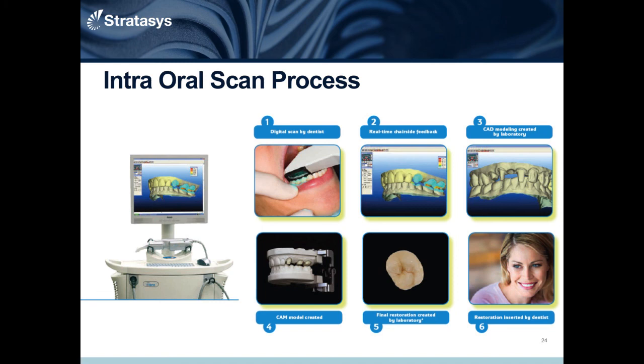This decreases your turnaround time, which adds more value to the services and products that you provide. Your doctor gets a better experience, the laboratory has a better experience, and most importantly, the patient has a much better experience. So this whole idea of intraoral scanning, if I talk to most laboratories today, well, I get one, I get two, I have a couple doctors, most of them are not interested. If we really dig deep and find out why, I think it's more cost related than anything else, because there is no doubt that these intraoral scanners are becoming more and more popular. They're less money, and they're extremely accurate.